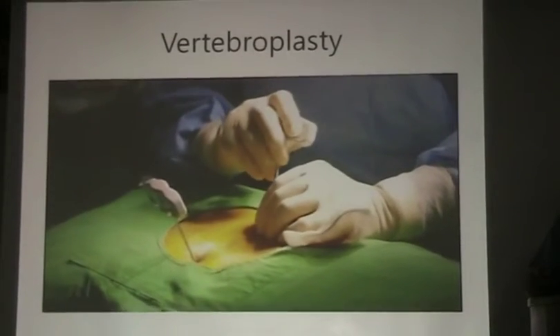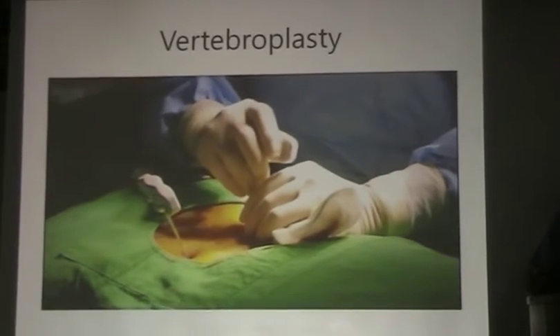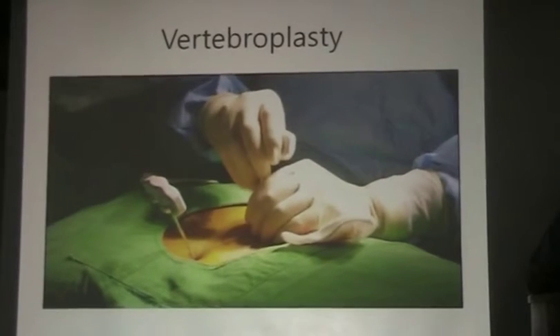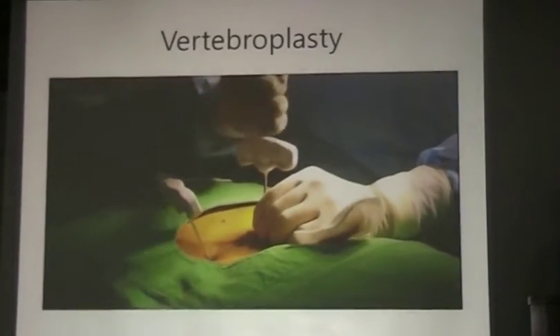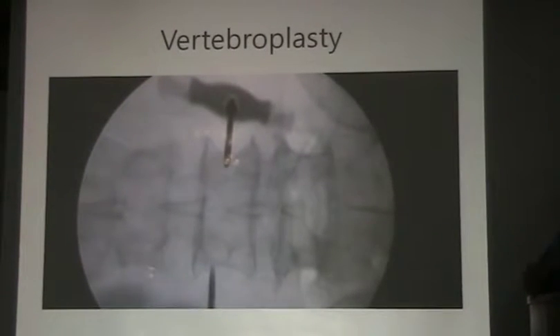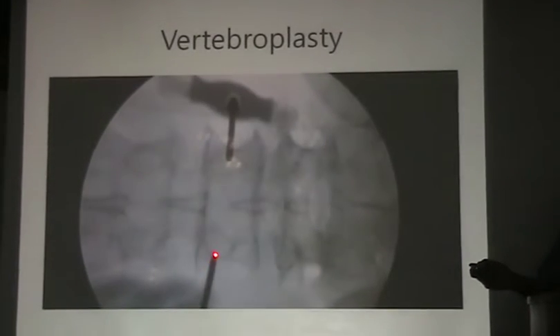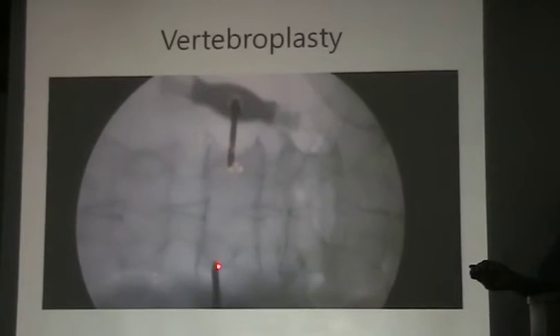And insert the vertebroplasty needle gently, exactly to the entry point. Just lateral to the pedicle. This is the entry point.